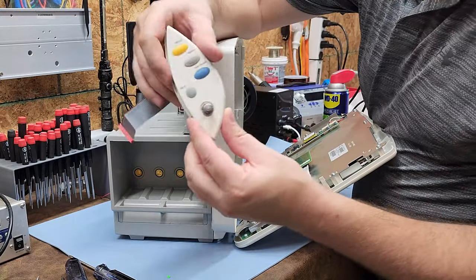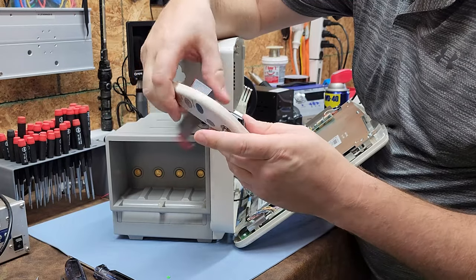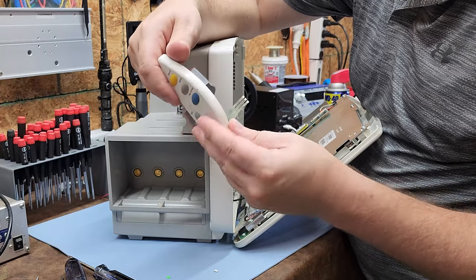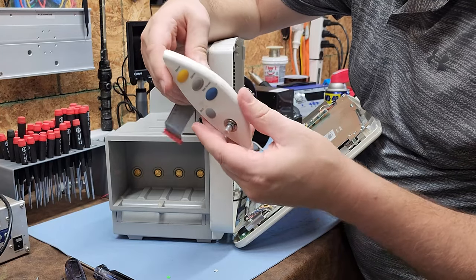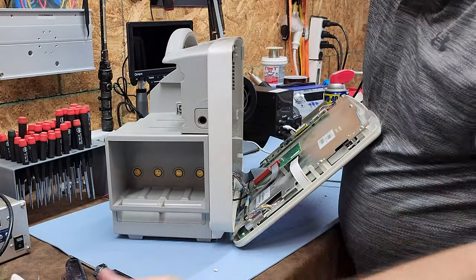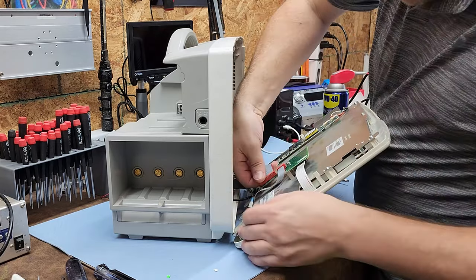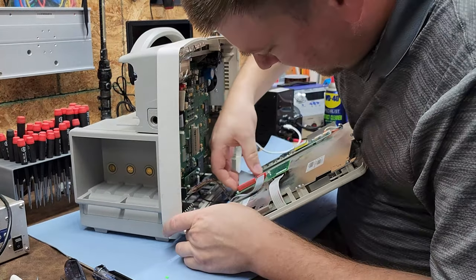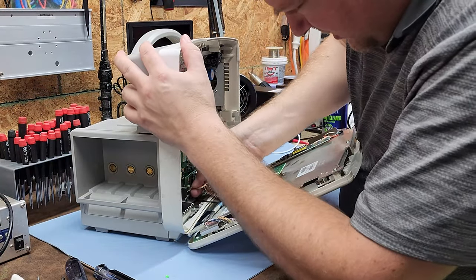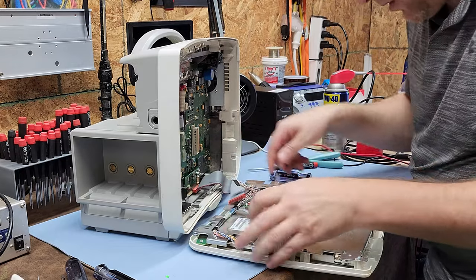Here is the rotary encoder — it's a push-button rotary encoder and it is a replaceable part. You could replace it with the Philips component or a generic one since rotary encoders are pretty standard. You also have your alarm silence and main screen interface buttons right here — so if the touchscreen fails, you can still operate the patient monitor.